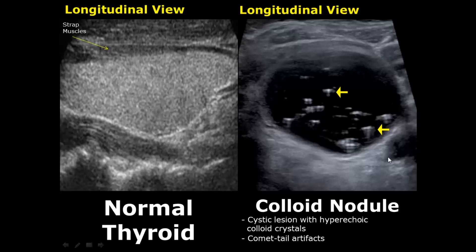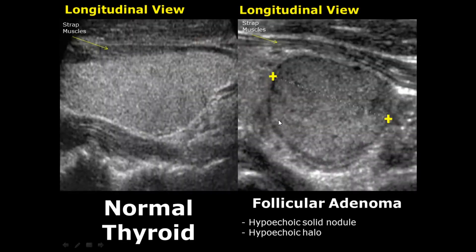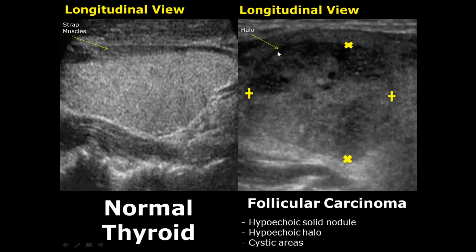A follicular adenoma is a hypoechoic mass — here it is more hypoechoic compared to the thyroid tissue, and the halo is even more hypoechoic, appearing darker. This type of appearance can be malignant. Here is a longitudinal view showing a follicular adenoma: a hypoechoic mass with a hypoechoic halo. Follicular carcinoma is the malignant form of this entity.